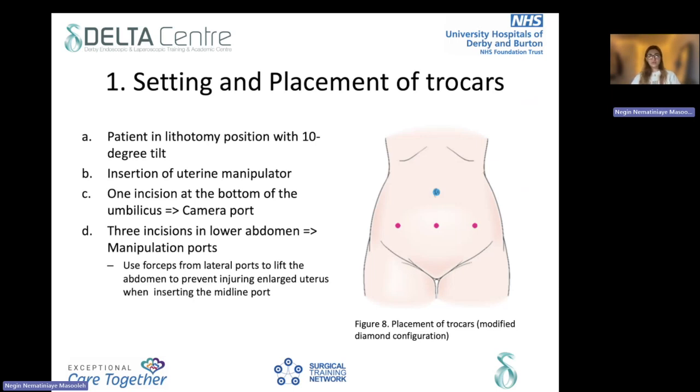You have to be careful when you're inserting the ports because the uterus is bigger than the normal, healthy uterus that you're used to. So you have to make sure you don't accidentally damage the uterus, because again it's very vascular and it can lead to hemorrhages.